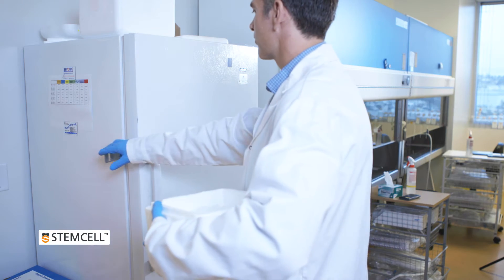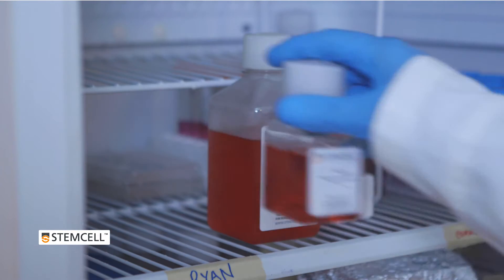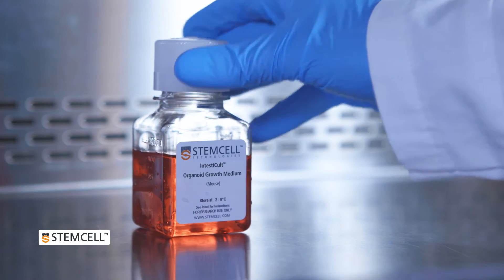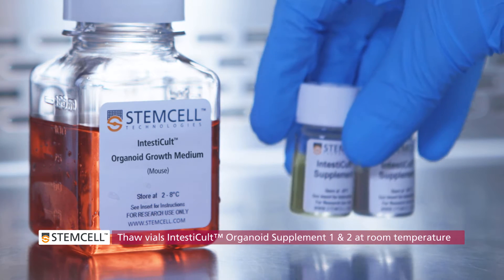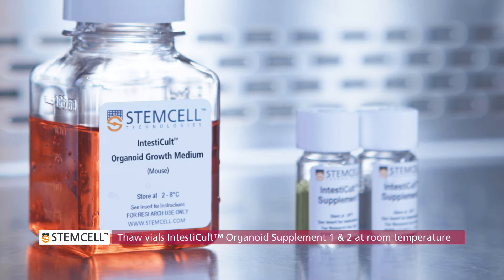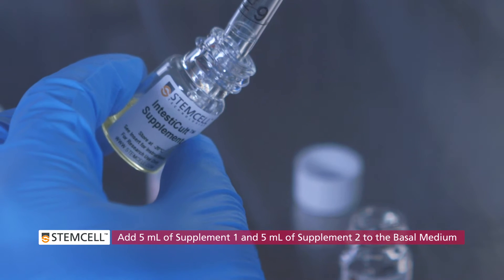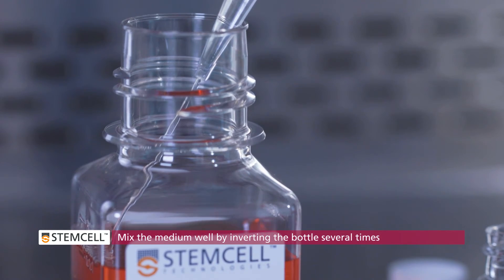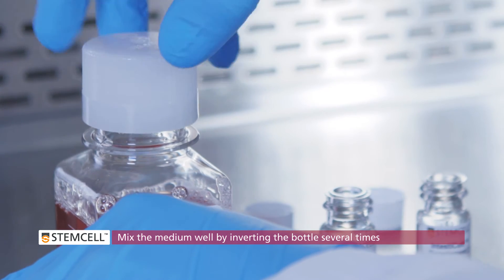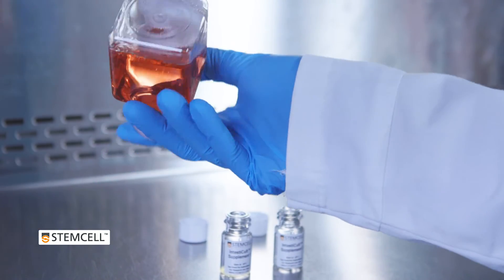Before you begin, place the bottle or previously prepared aliquot of complete intesticult organoid growth medium at room temperature. If you do not have any complete medium prepared, remove the basal medium from the refrigerator and place on the bench top to warm to room temperature. Remove the vials of supplement 1 and supplement 2 from the freezer and leave to thaw at room temperature. When thawed, add 5 milliliters of supplement 1 and 5 milliliters of supplement 2 to the bottle of basal medium. Replace the cap and mix the medium well by inverting the bottle several times. The medium must equilibrate to room temperature before use.